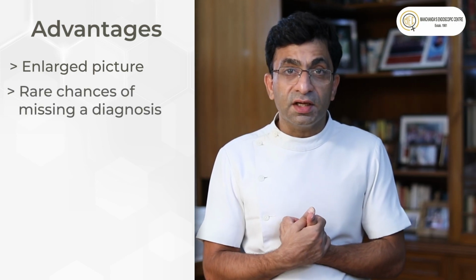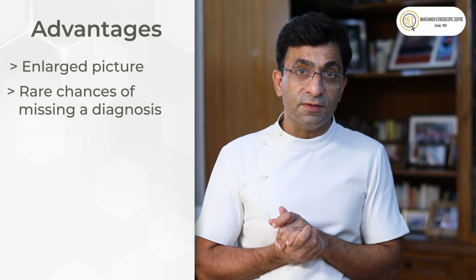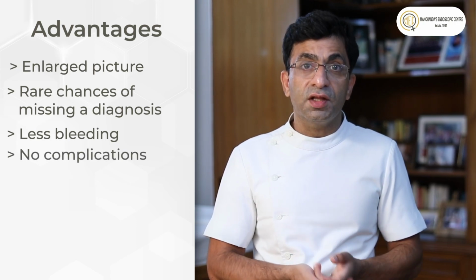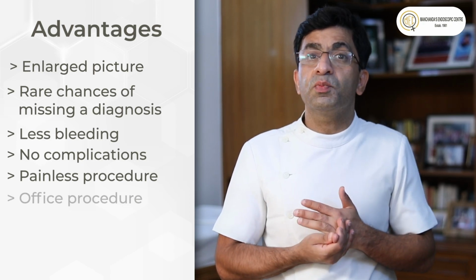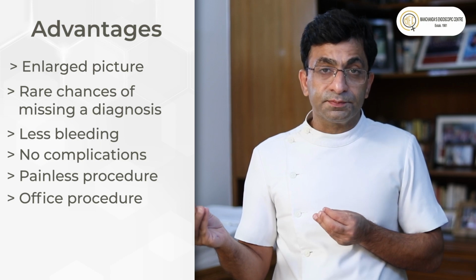And like I listed, the advantages are what? It's an enlarged picture, so the chances of missing anything, or not being able to make a diagnosis, which you can have with a blind procedure like the olden days DNC, is not there. Bleeding is much less, complications are not there, the patient doesn't have pain. It's literally an outpatient procedure. Patient comes, gets it done and walks away. These are the various advantages of this tool vis-a-vis the older technology.